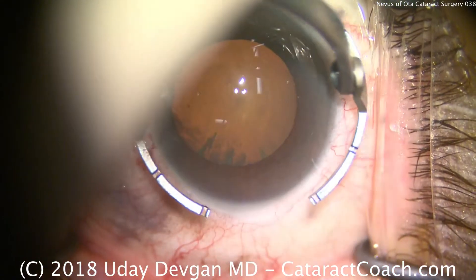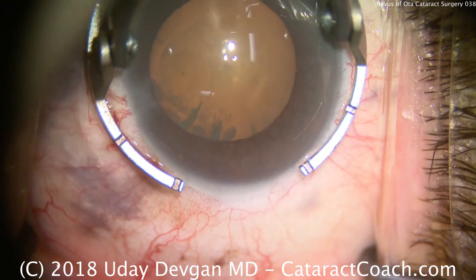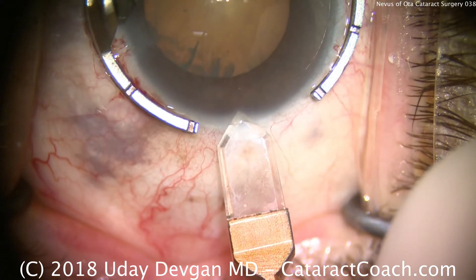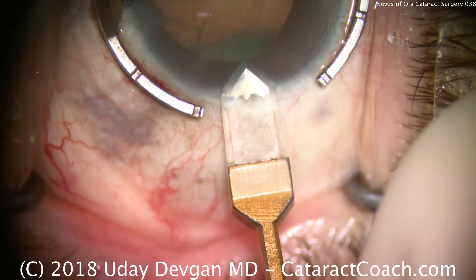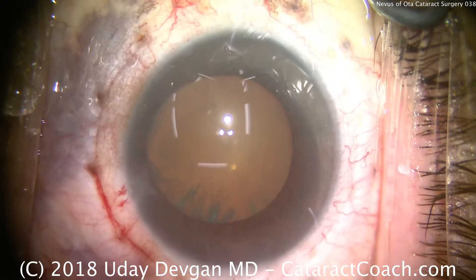We're going to make our incision here. We'll use a diamond keratome, holding the eye with a fixation ring. There's the diamond keratome making a nice, clean, single-plane incision. That looks great — that's where we enter the eye. That's ideal.